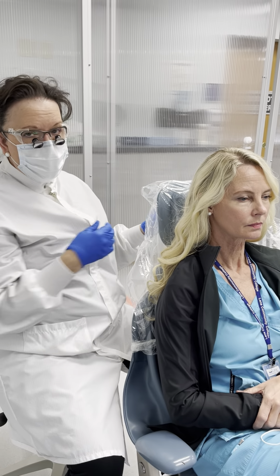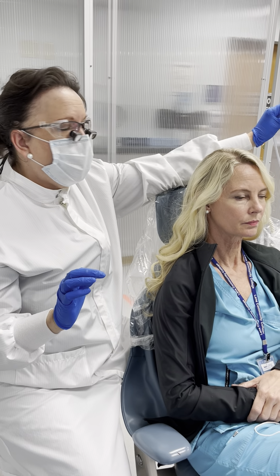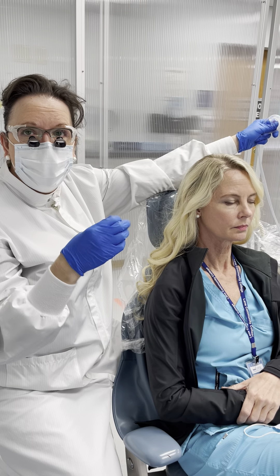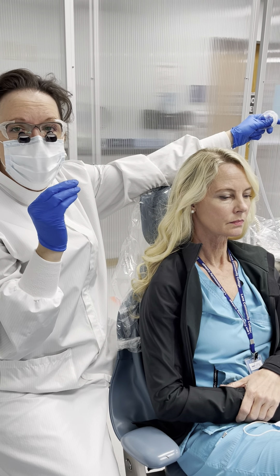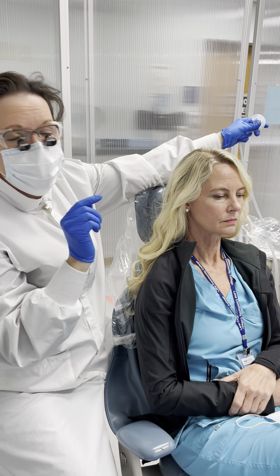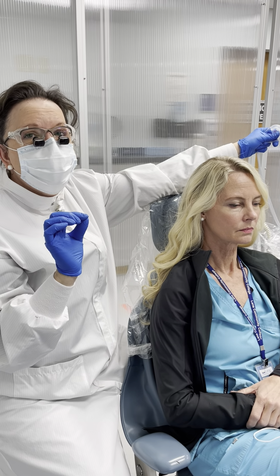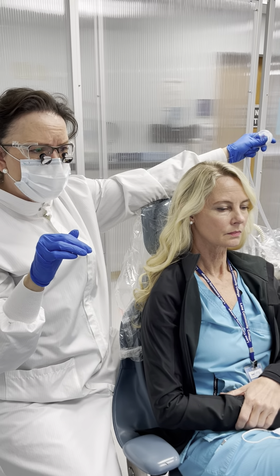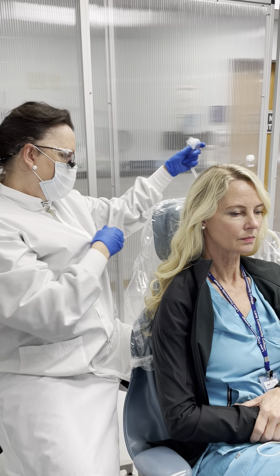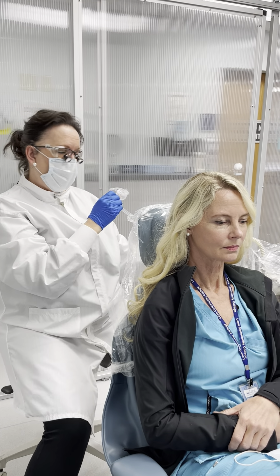If you're not sure, you can take the mask, put it in a Ziploc baggie, and actually try it on the patient to see if it fits their nose. If it's not the right size, you can put it back in the packaging — just make sure you put a little note on the packaging that it's a clean mask, so it gets put back in the general supply and everyone doesn't think it's been used. We already know Chris is going to be a size small.